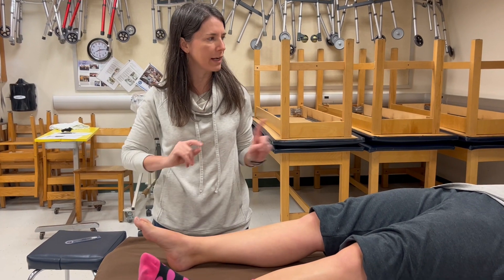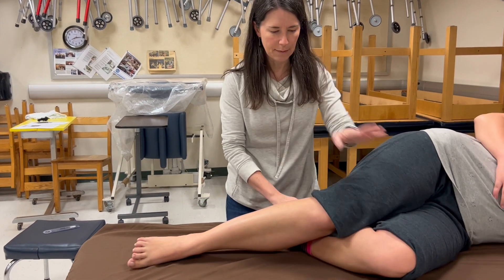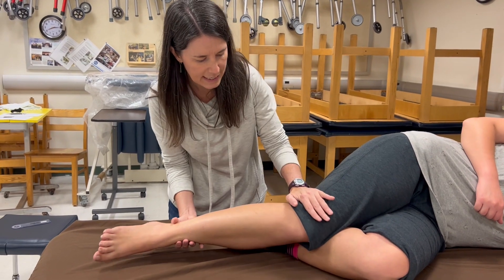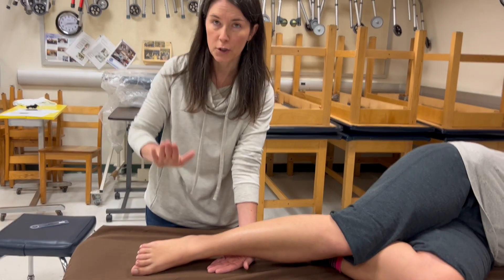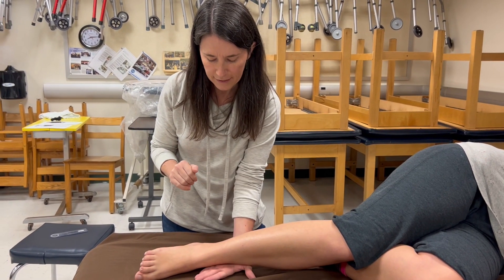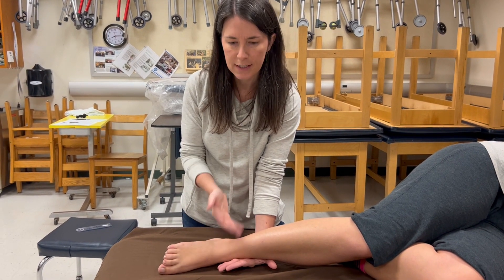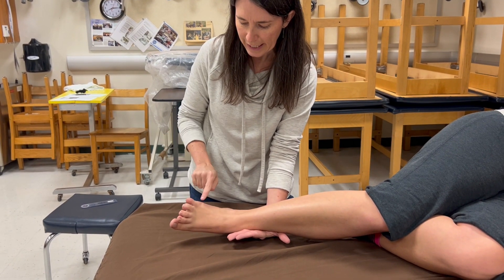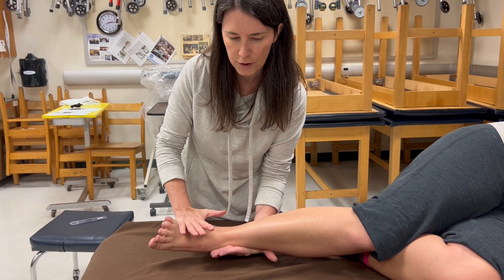For eversion, I have her roll to her left side. She can keep the top knee bent so she doesn't feel like she'll roll off the table, and the thigh and knee are supported. When she everts against gravity, I try to push her foot back down to where it came from. Stabilization is on the medial tibia just proximal to the ankle joint. I cue: bring this pinky toe up toward the ceiling — don't let me push you down. My hand is on the fifth ray without crossing the MTP joints. There's her four and five.